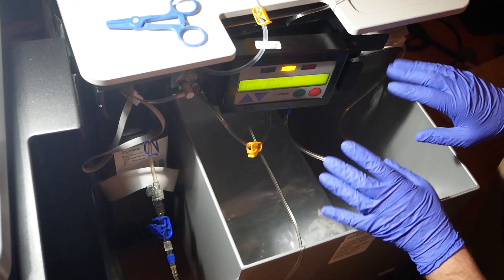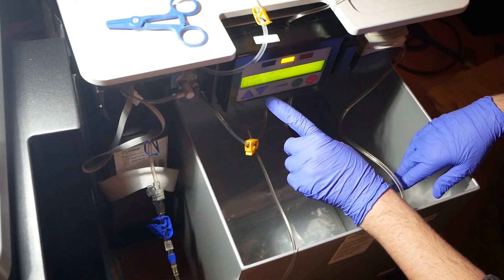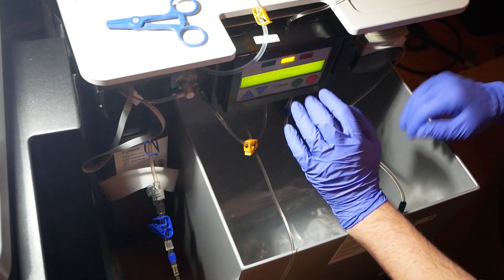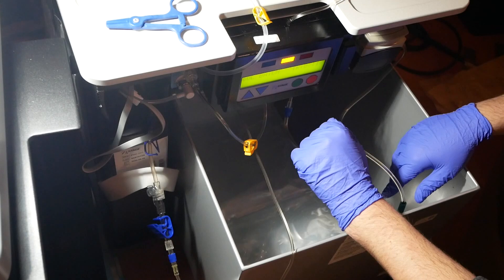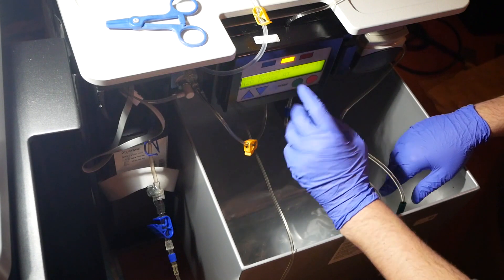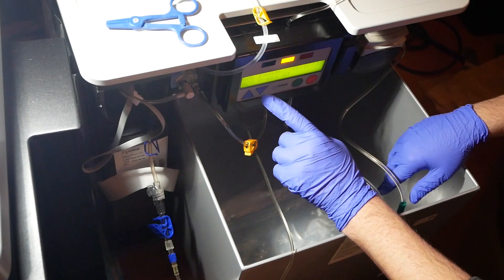Now I've got all my lines hooked up. I'm going to close the door - you don't really have to do the connections now since next it's going to ask you to connect the lines anyway, but we're a step ahead. It doesn't hurt to go ahead and do it all at the same time. So we hit green again.